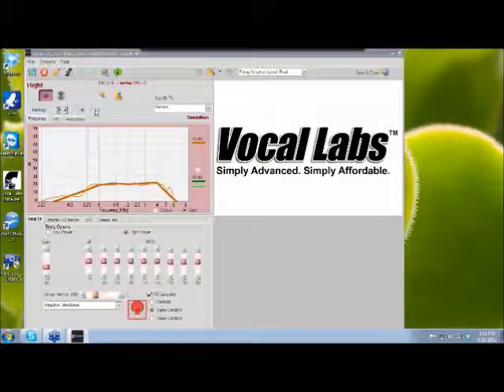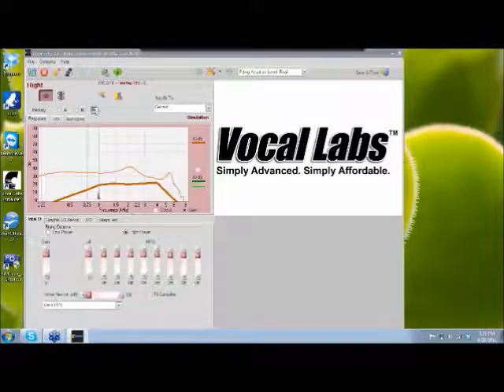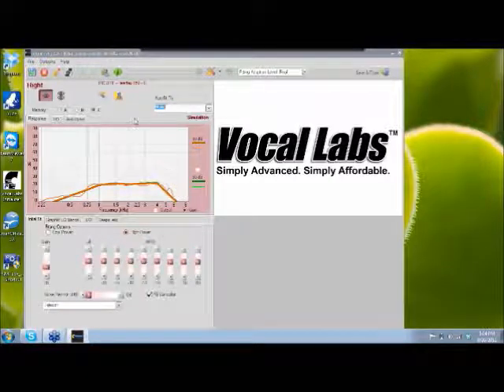The reason I gave this patient a third memory is because this particular product comes with a telecoil in it, okay? So I'm going to put a telecoil in so the patient, when they're on the phone, has a telecoil setting. Usually telecoils you can almost leave unprogrammed at full on and they won't be too loud. But if you do want to apply some type of auto fit, what I recommend is using the music auto fit. Because a music auto fit traditionally has no compression at all, and you're not going to want any compression in a telecoil mode, okay?